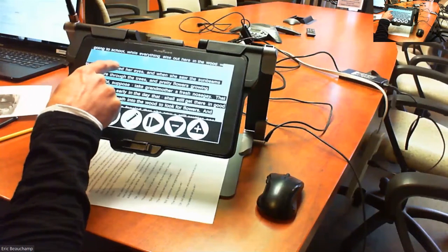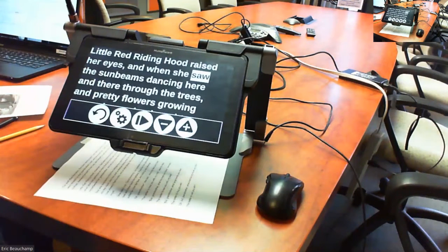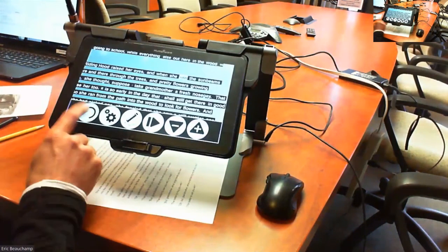The idea would be to press and hold on that word and have the ability to change that word and write it correctly, and then store it into your results. But for now, unfortunately, you'll have that 1% chance of getting that error. But that's in the future versions.